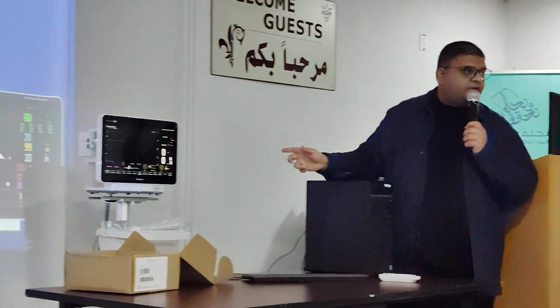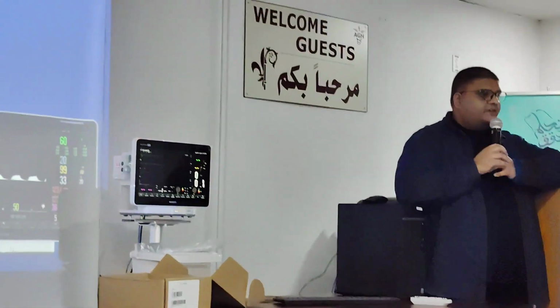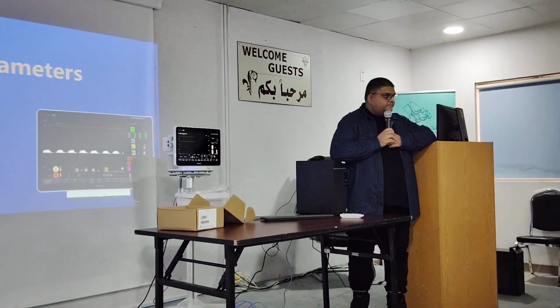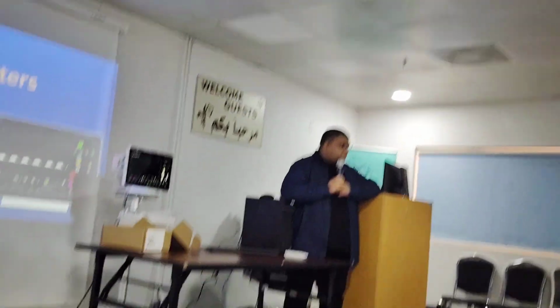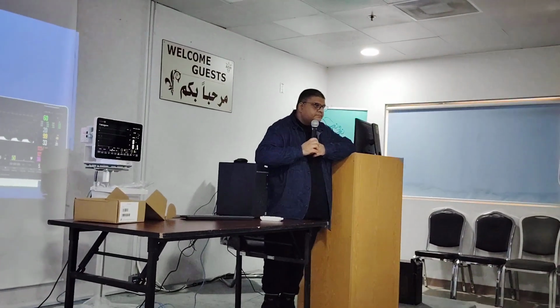Any questions you have before I go on to my PowerPoint? Can this portable one be used in MRI rooms? MRI rooms? No, it's not.